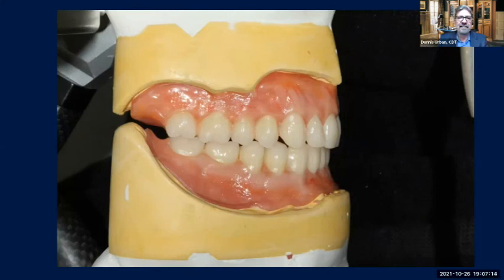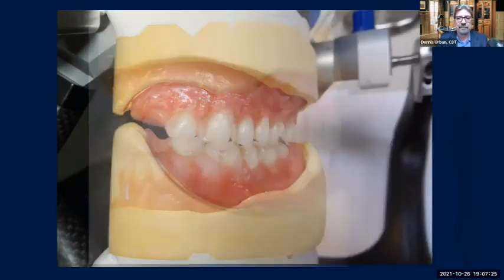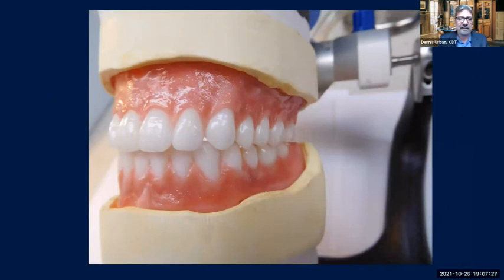And I'd like to have a patient see what these dentures are going to look like when they're finished. And this is what this does. We have a diagnostic wax up in crown and bridge. Why can't we have a nice characterized wax up on the removable side? And there's another photo of a denture try-in that might work with the denture try-in and setup.